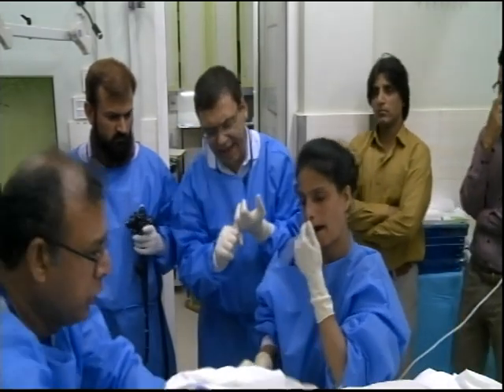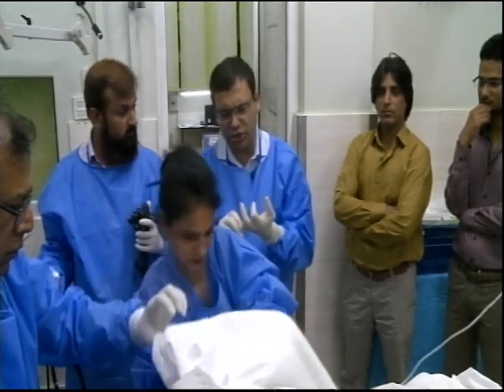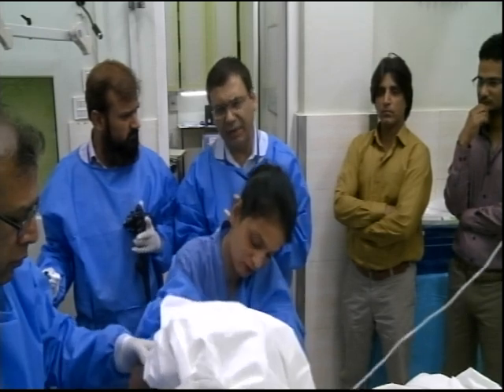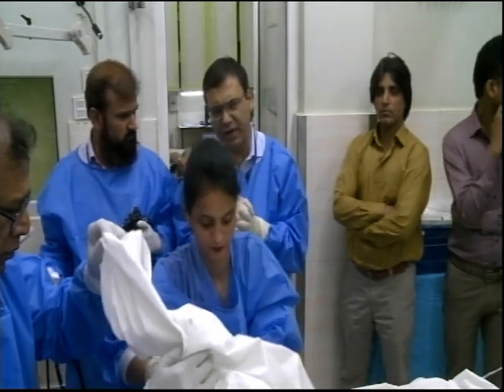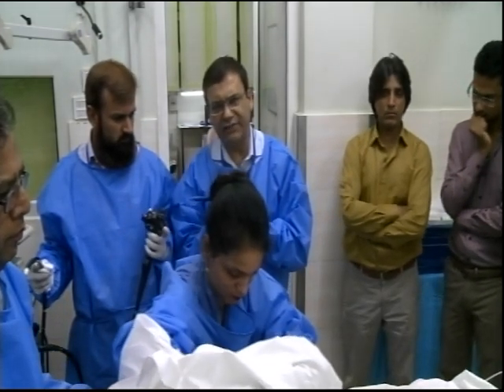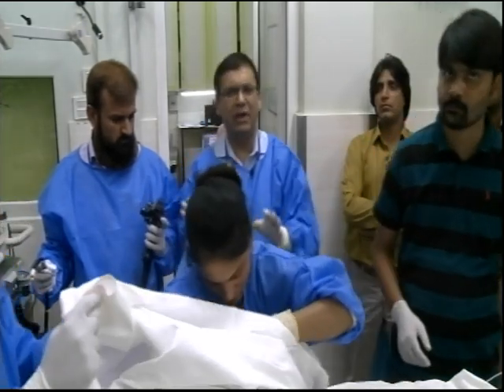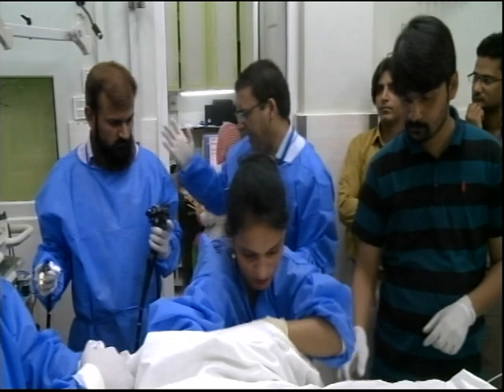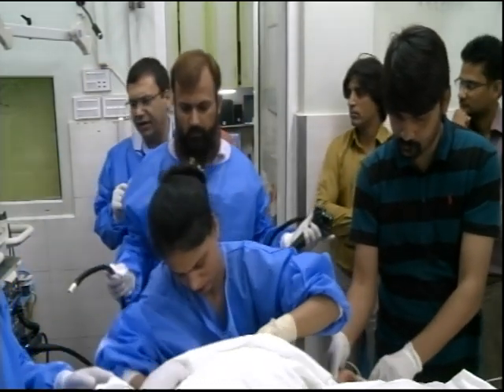If you are looking at the head of the pancreas and papilla, mainly D1 and D2. Body and tail, gastric images from the stomach, and for the celiac artery and SMA, GE junction, a little bit below the GE junction. So we're going to try to simplify like that and make it more understandable.